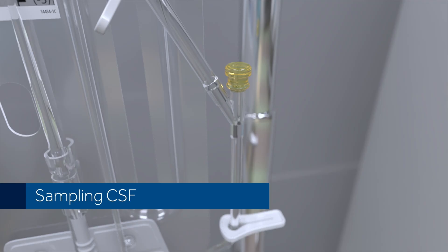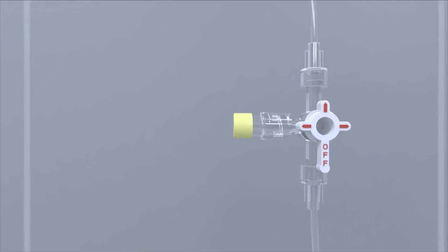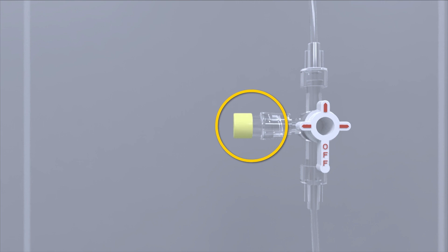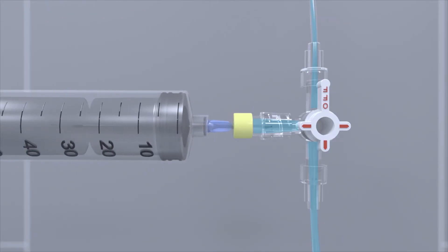Sampling CSF. CSF can be sampled from either the patient line sampling site or the drainage line sampling site. When sampling CSF from the patient line sampling site, position the patient line stopcock as shown. Clean the sampling site with isopropyl alcohol. Allow it to air dry, usually 30 to 60 seconds. If using a system equipped with interlink needleless sampling sites, access the site using a needle adapter or a 25 gauge needle.